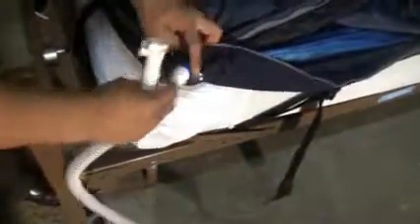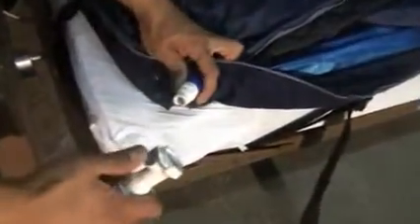After inspecting your air manifold for kinks, you may connect your tube set to the air manifold. Your air tube set is what will route the air from your air control unit, which will hang on the footboard of the bed frame, to be able to inflate the air overlay at all times. You would like to make sure the hose snaps in place firmly to the unit to ensure proper connection.